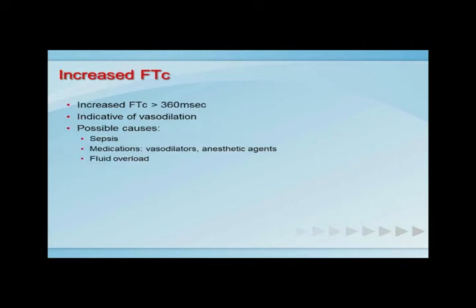Increased flow time corrected, or a flow time corrected greater than 360 milliseconds, can be indicative of vasodilation. Possible causes include sepsis, medications such as vasodilators or anesthetic agents, or fluid overload.